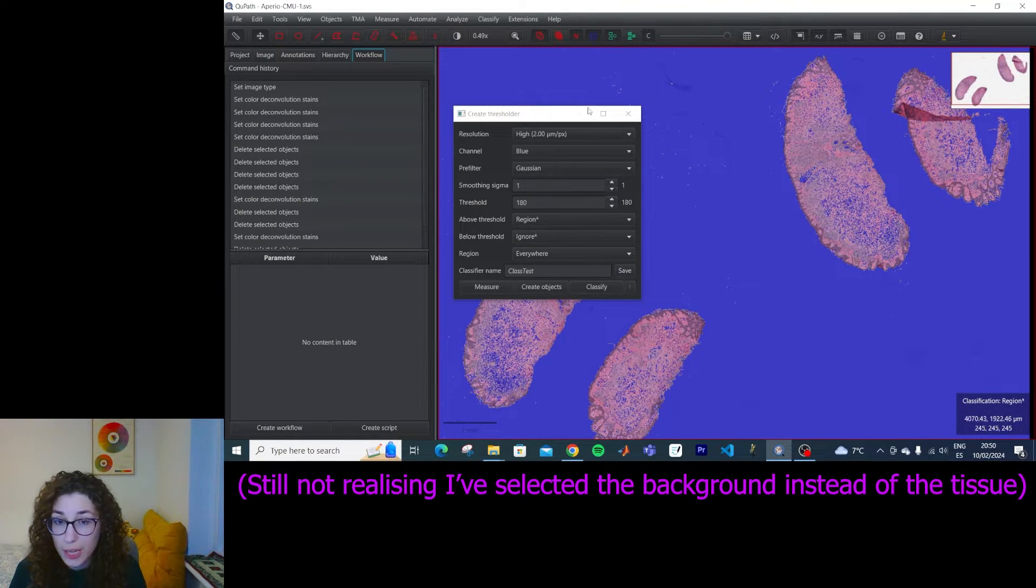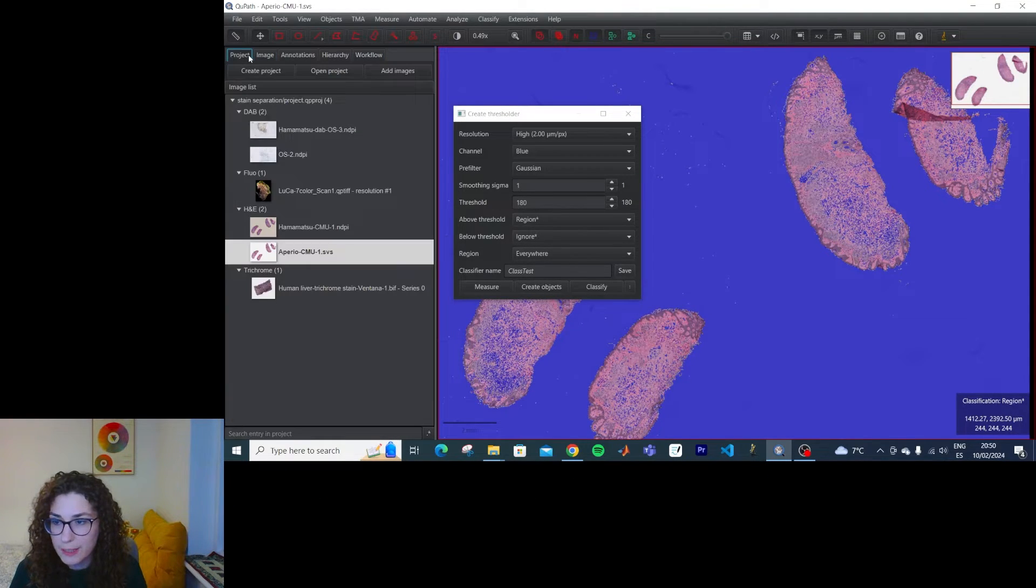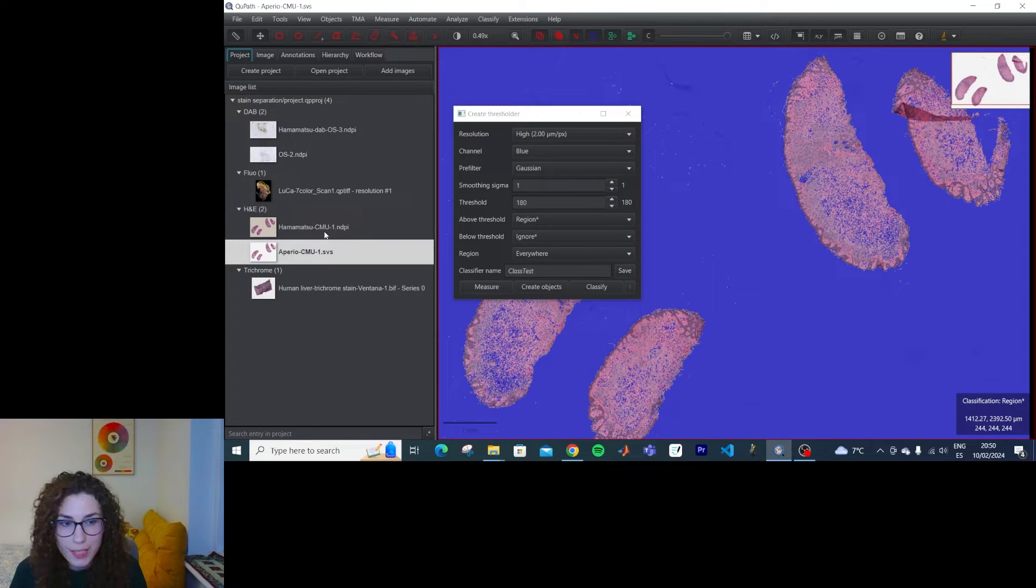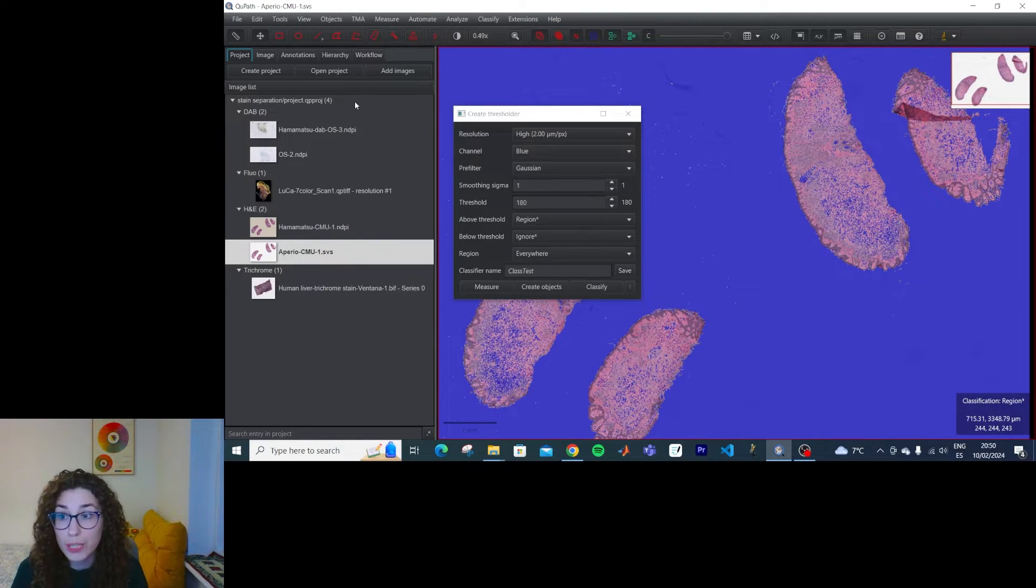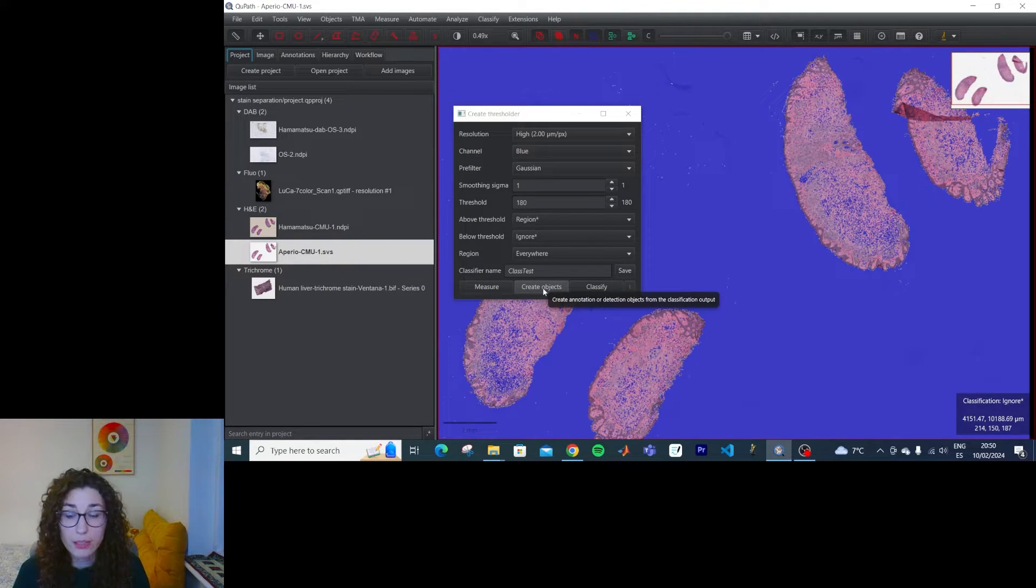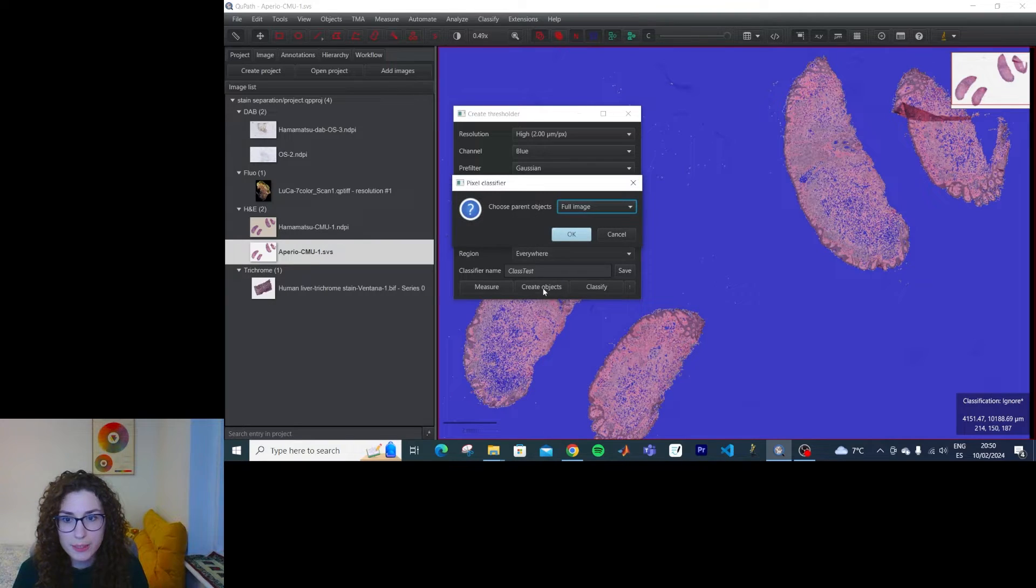And in this, and I want to do the exact same thing on the other image that has a different color appearance to see if the same classifier would work.